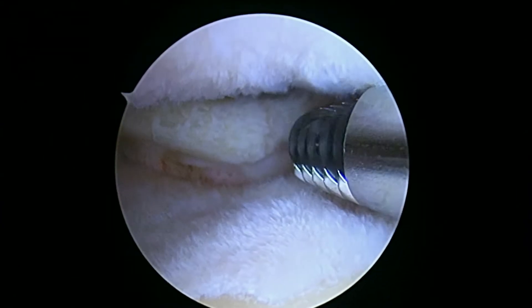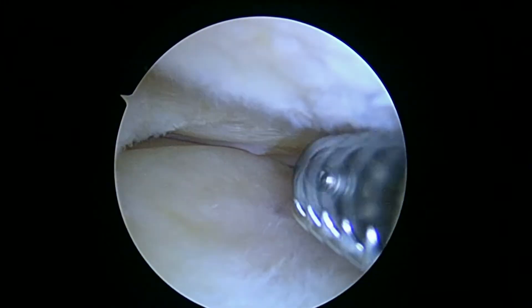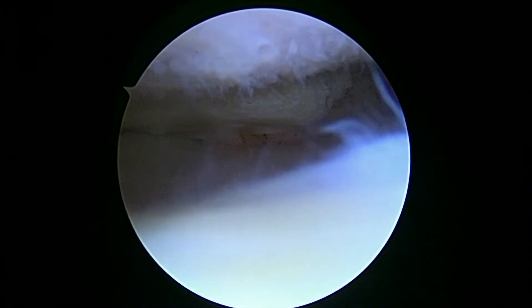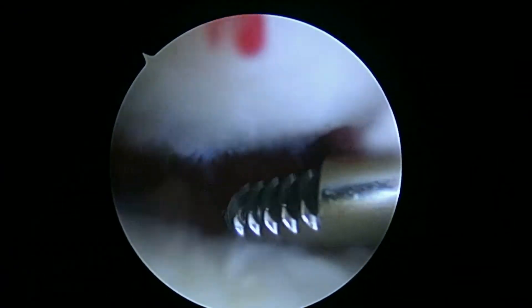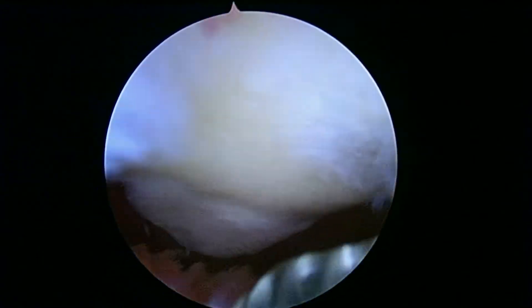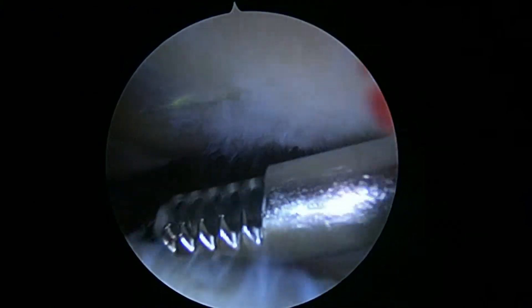Okay, let me see if I can focus that any better. That's about it. So next we're going to look at the patellofemoral joint. Okay, this is the patellofemoral joint at the top of the screen. And just as expected, it's not normal either. You've got a fair amount of arthritis here. It's not too bad over here on the lateral facet, but the cartilage overall is pretty thin. And as we get closer to the medial facet, you can see how frayed it is. Now we'll look down in the trochlea — not too bad in the trochlea.